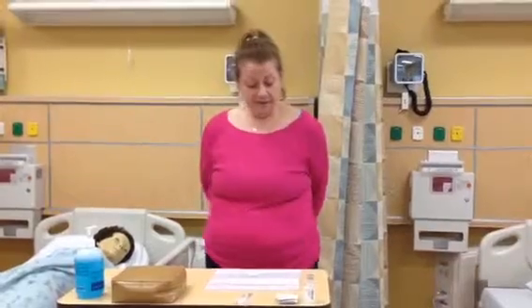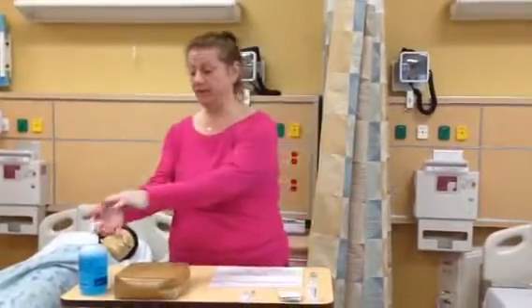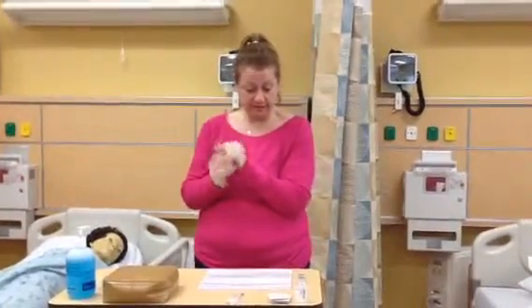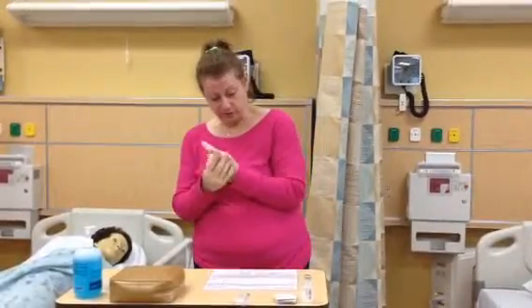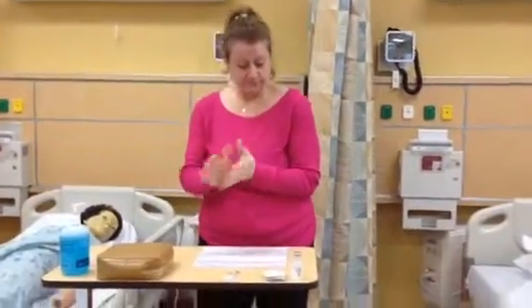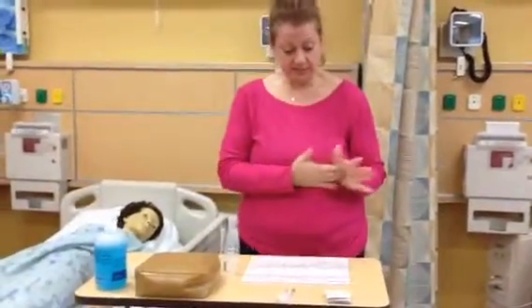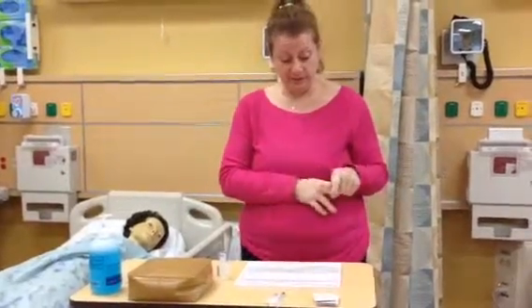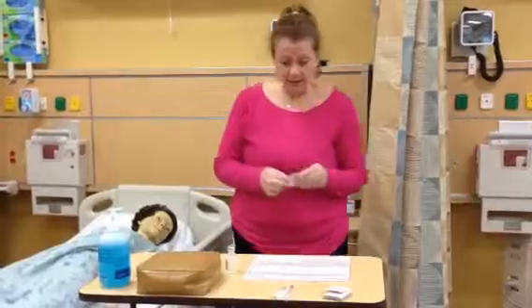Patient is Mary Smith. I will prepare her medications outside the room. I will perform hand hygiene. I will read the MAR, make sure that it is Mary Smith. Check her med drawer, look for her Vistaril, which she has right here. The patient has expressed that she has moderate anxiety, so we will be giving her 50 milligrams of Vistaril. I will then alcohol the top.